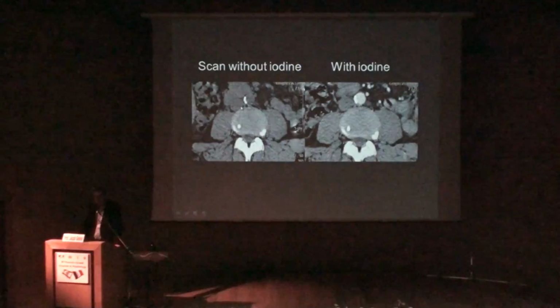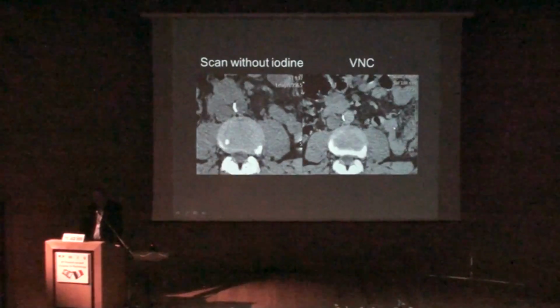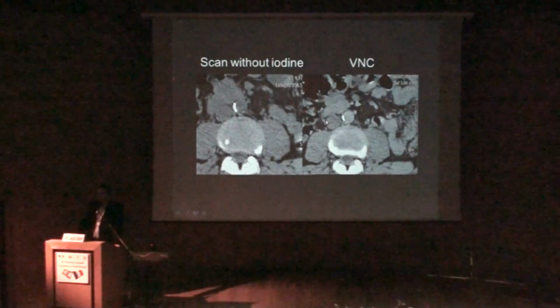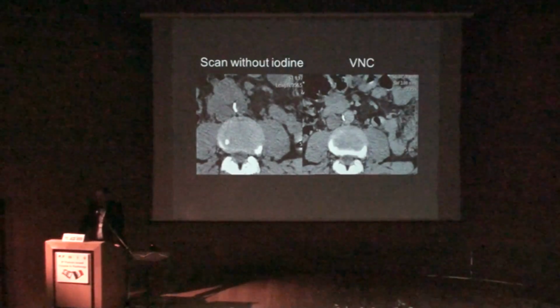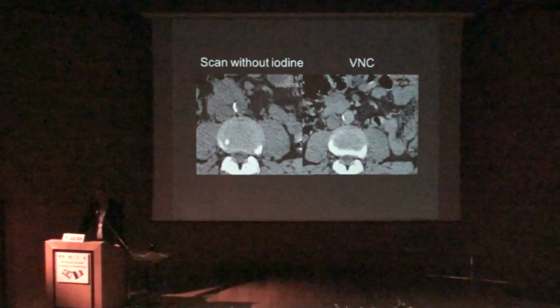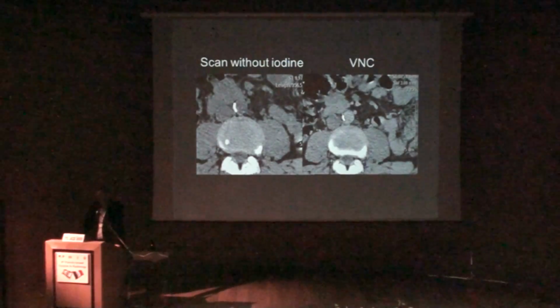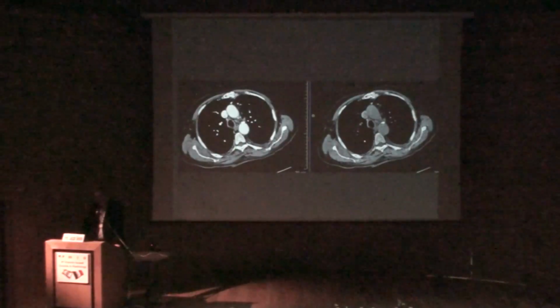And again, an image without iodine, with iodine, and with the VNC. They are getting better, they are not perfect, the VNC images. We can sometimes delete stones from those images, so that's why we didn't shift totally to VNC images.